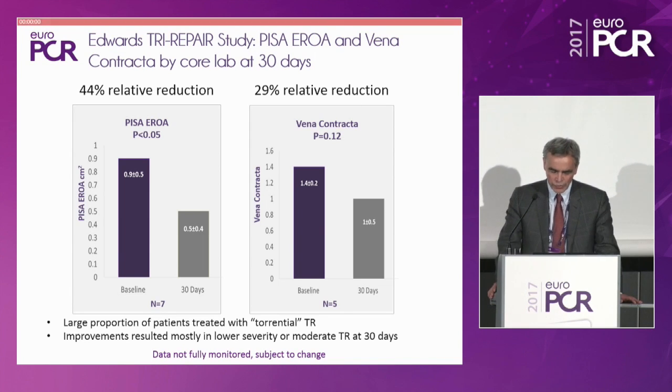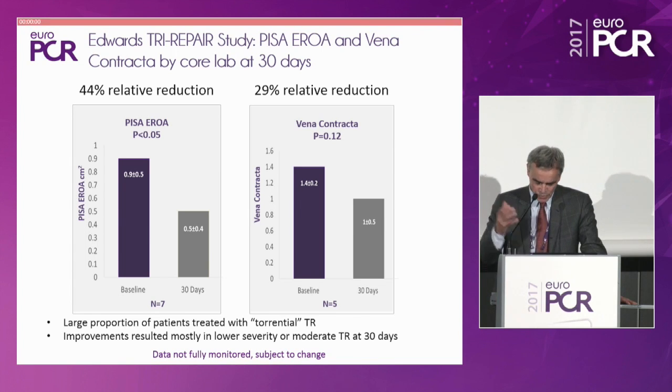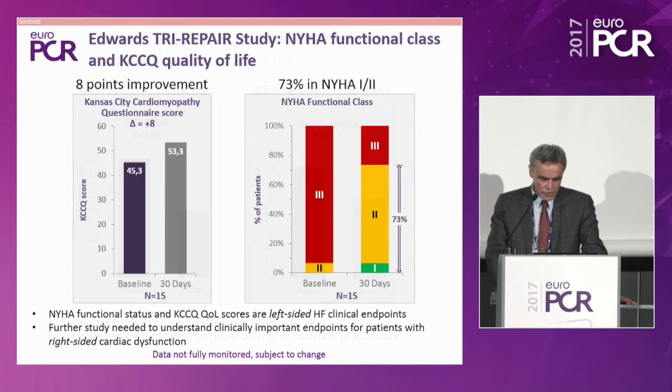And then, of course, you have to accept that some of these patients remain with some gaps, and that is something that maybe Dr. van Barleben can comment on, you see further improvement over time in these patients. So this also is associated with improvement, as you can see here, in functional quality of life parameters, but also in the functional class. And this is quite impressive, and I hope very much that we can sustain these results.